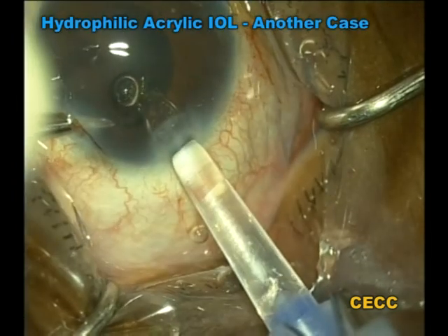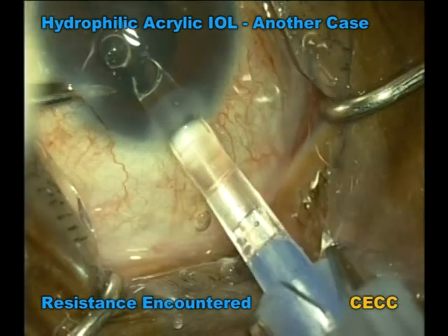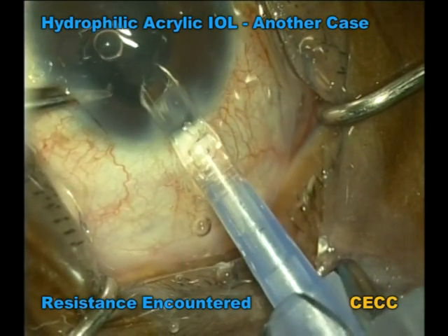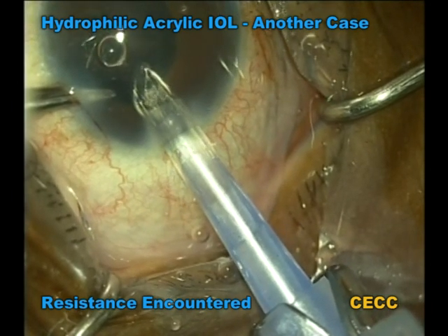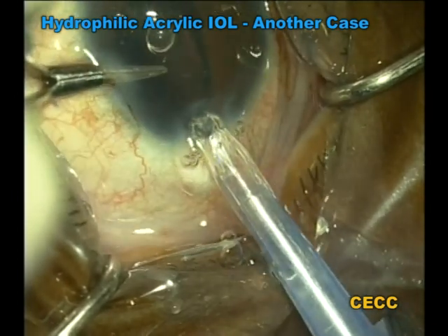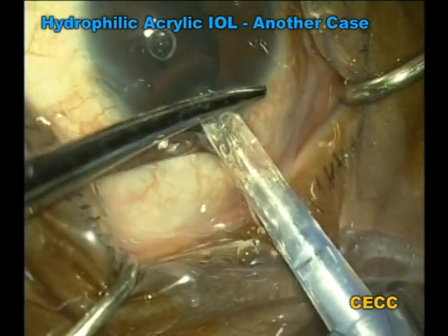In the next case, which is quite similar to the previous one, resistance was encountered throughout the implantation process. The trailing haptic could never emerge from the cartridge because it was captured between the plunger and the cartridge wall. This usually results when the axis of the plunger is not aligned with the axis of the cartridge nozzle, or when the silicon tip is too bulky. Ultimately, the cartridge tip had to be amputated along with the trailing haptic to release the incarceration. This IOL was also exchanged with a similar design IOL.